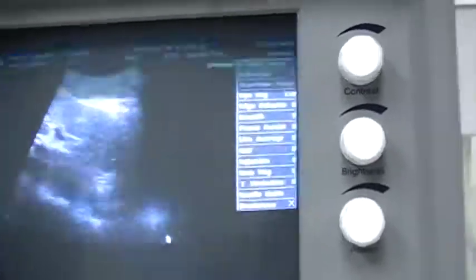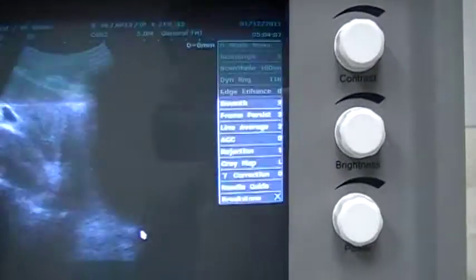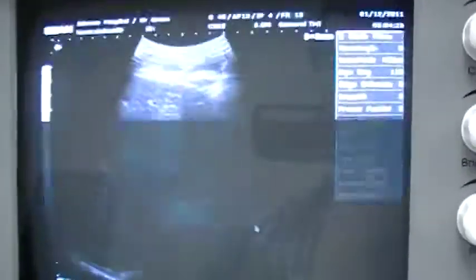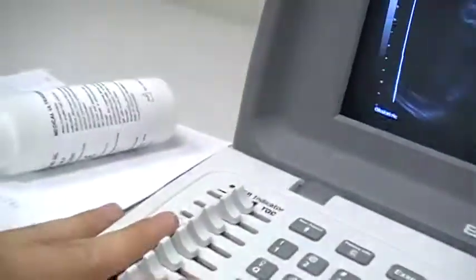The deeper the organ you are scanning, the lower the frequency you should use. You can also adjust the depth using this button — adjust it to the depth you want. If the image is still not good after adjusting the depth, continue fine-tuning.